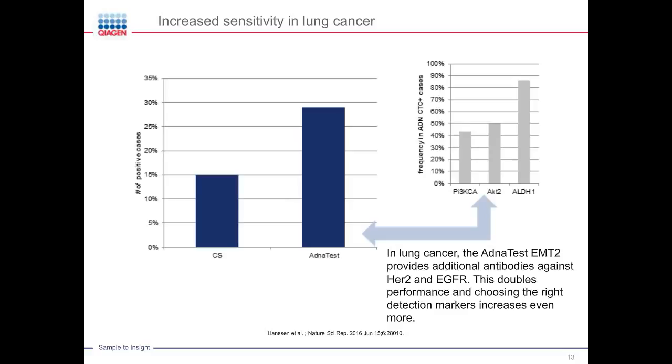Interestingly, by the way, this is not really clear here in that picture, therefore I tell you, you see that 80% of the cells we captured here were ALDH1 positive, giving you a very good idea. Actually, most of the CTCs that we captured by using the antibody mix were probably already in a tumor stem cell-like state, or at least in the EMT state.